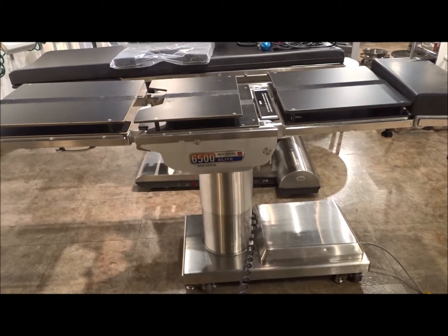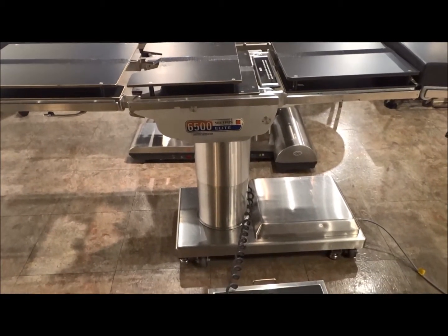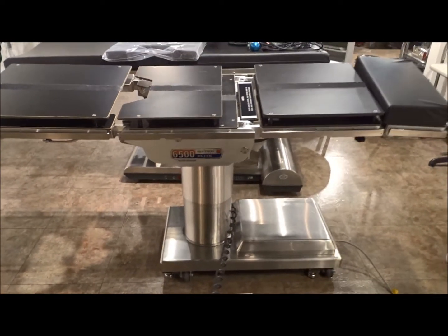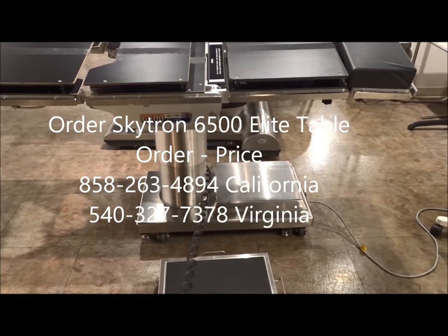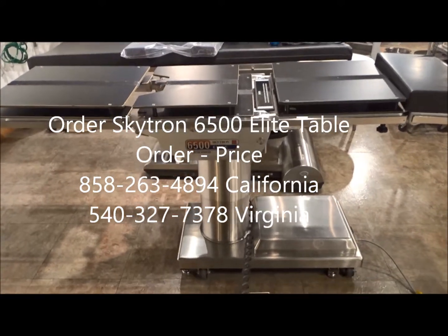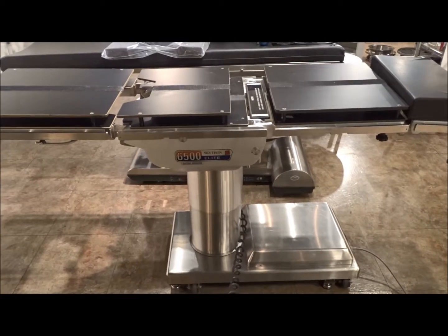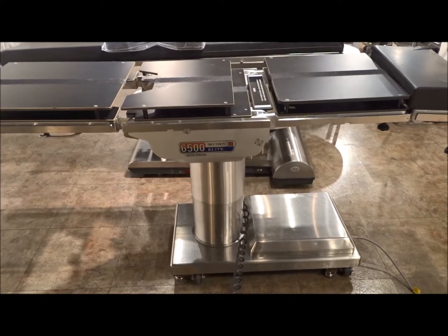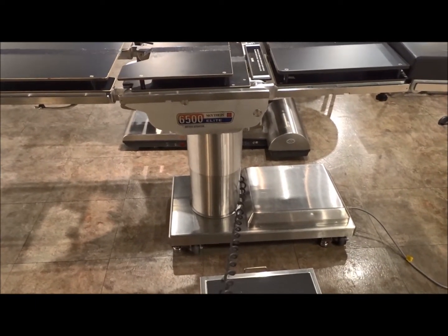Patient weight capacity is 500 pounds. We'll go ahead and do some of the tilting — we'll tilt it left, and then we'll go ahead and tilt it right. This particular table is a general surgery procedure table. It's going to be used for a lot of different functions, but it's also known as a table that you can do C-arm surgeries with, and the tilting is going to be a key factor for that.